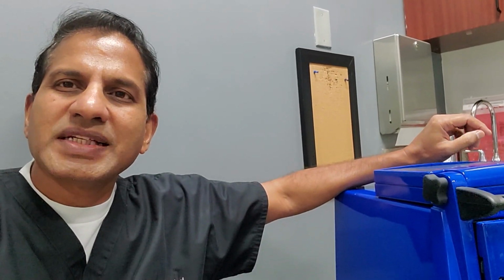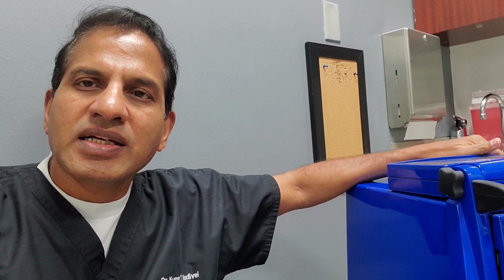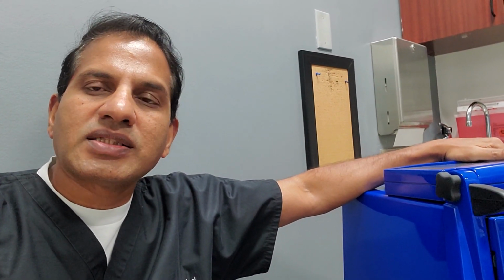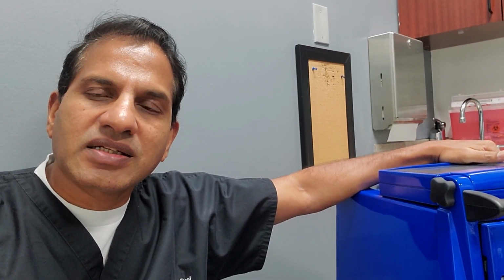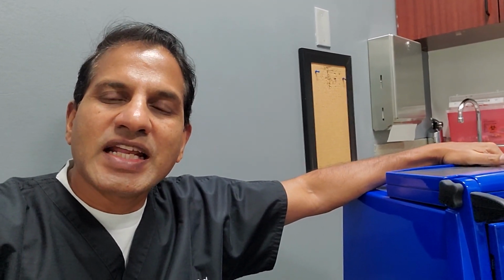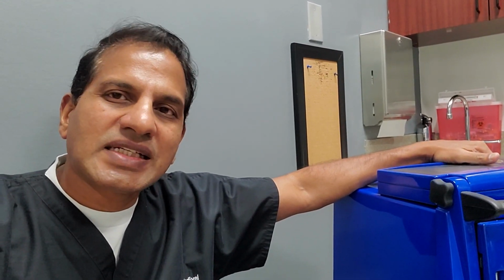So in addition to the deep gum therapy helping you remove the tartar and the plaque and the bacteria, the laser is also going to help reduce the bacteria and decontaminate the area. That's what we call laser decontamination or laser bacterial reduction. Those are the benefits of having the laser gum therapy in addition to the deep gum therapy. So those are the differences, and whether you're a good candidate for a deep gum therapy or you're going to benefit from the laser gum therapy, talk to your dentist and they can help you.